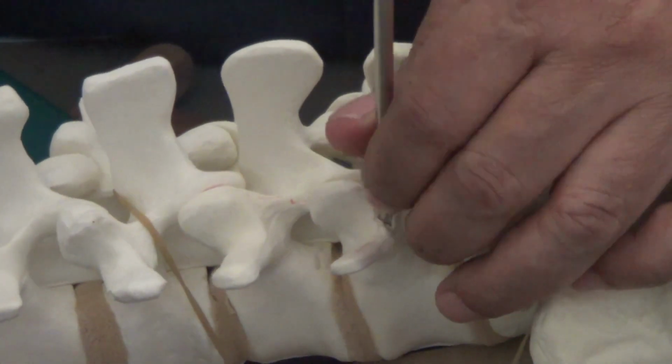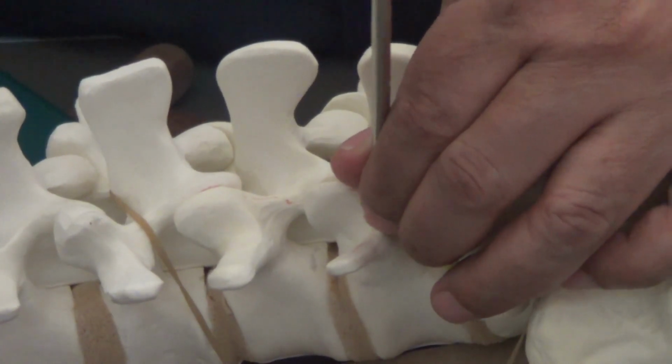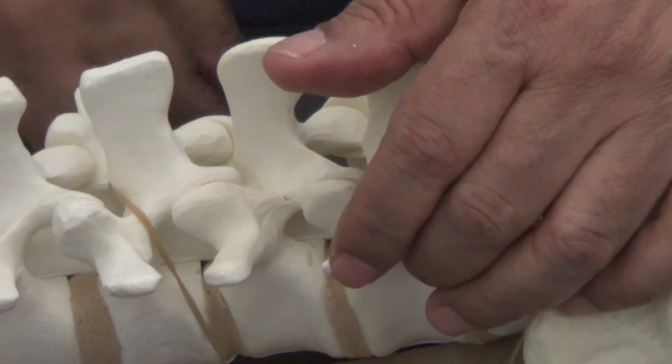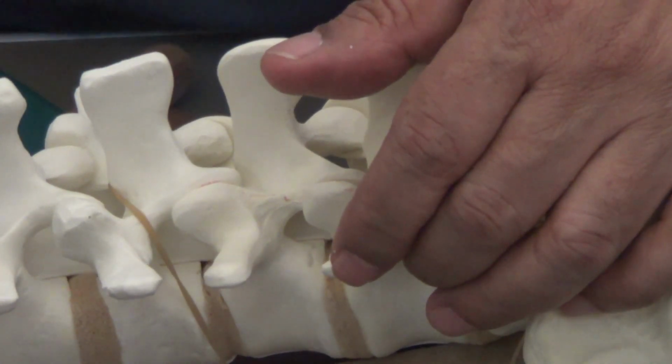Classically, you have some special awls like the Lenke's awl, which let you move around, but by and large it is the preference of the surgeon.